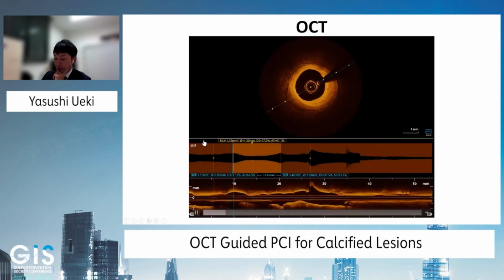So this is the baseline OCT imaging. As you can see here, there's a very thick and concentric calcification in the lesion.